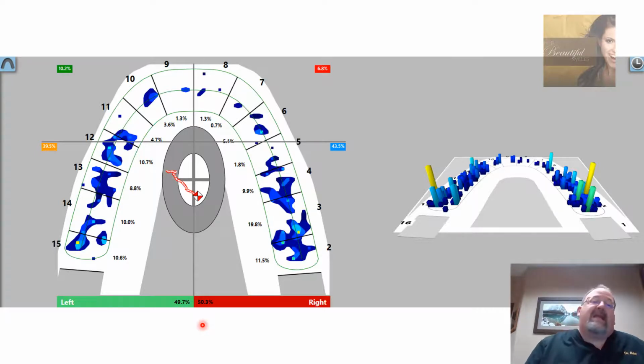And it's great. I wish I would have known that we would have had the results that we were going to have, right? But we served the patient. She has every confidence in the technology and the treatment plan. And I think this is a great, simple way to just show you how important occlusion really is. Because we could have built her a splint, we could do ortho, full mouth reconstruction, we could do all sorts of stuff to try and eliminate her pain. But really what she needed was just a minor coronoplasty, and she's feeling the benefits.